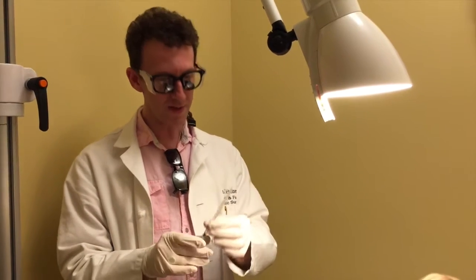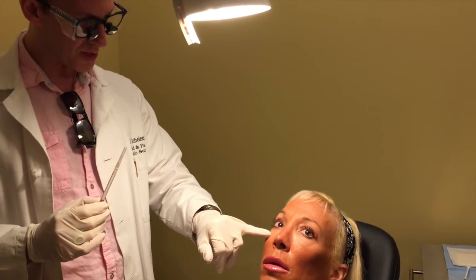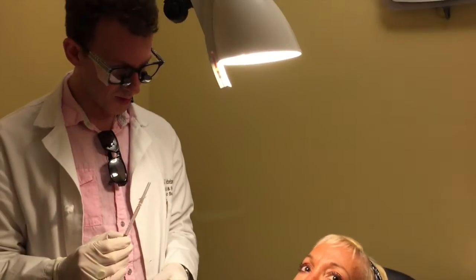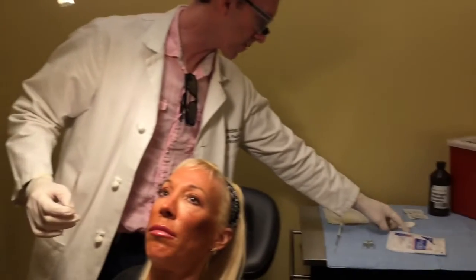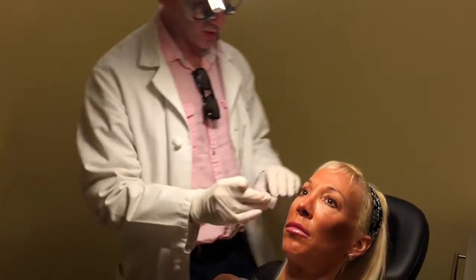But what we're going to see here today is we're going to put the hyaluronidase into this area here, and we'll put it under compression, and then we'll get to see what it looks like afterwards. Okay, so what we're going to do now is we have the hyaluronidase in this cc. We have about 1.2 cc's here, and we're going to layer it right in this region. This is where we think that this Juvederm or Restylane, where the hyaluronic acid was placed all those years before. So we have a little alcohol swab here. We're going to clean off the area first that we're going to work on.